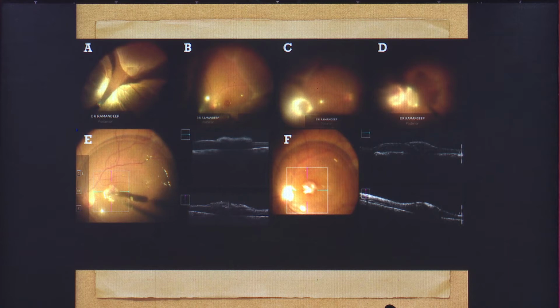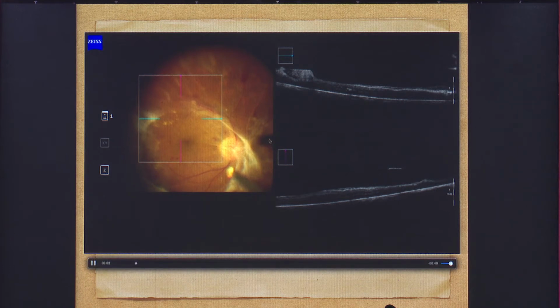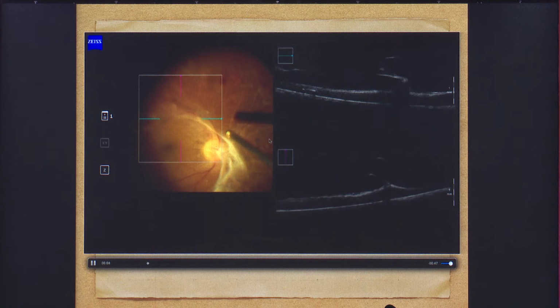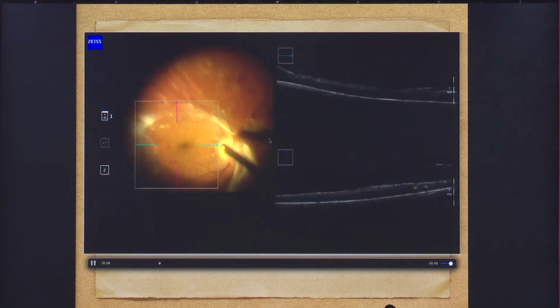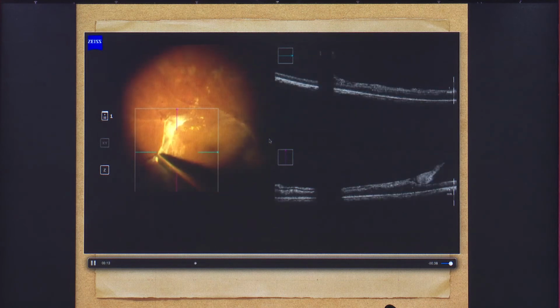So people are working on the punch biopsies also. There are so many things happening in this part. And this is what the diabetic vitrectomy looks like. For any diabetic vitrectomy I'm doing, I will do an intraoperative OCT in the end to see whether there is any residual membrane left or not. I used to run it intraoperatively also most of the time.